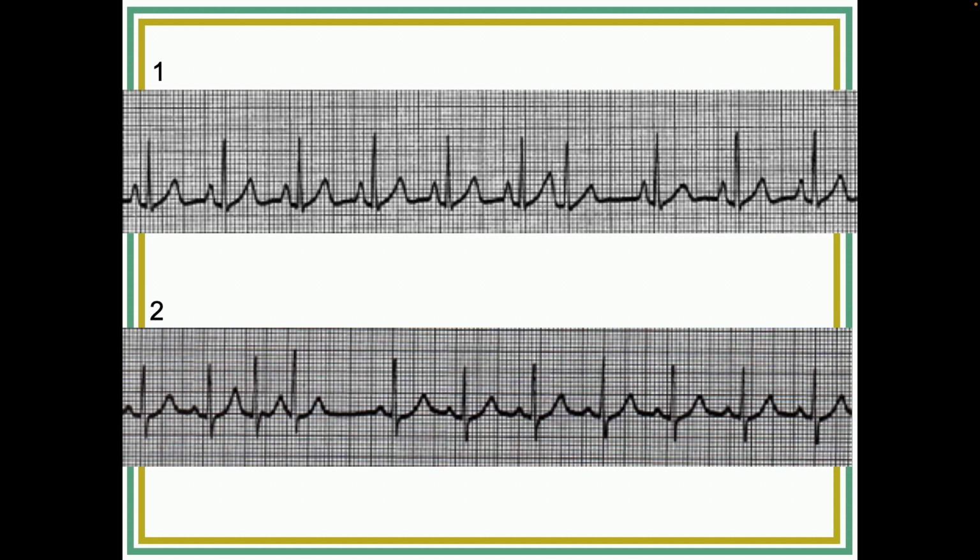And then you can move along, so you can come back to that. So if I were to ask you what you see here, the answer would be a normal sinus rhythm with a premature beat. Later today, we're going to start identifying what kind of premature beat. But for now, all we're saying is either premature beat or escape beat. Okay? Any questions? Is there anybody here who doesn't see the normal sinus, doesn't see the premature beat? Any questions about it? Okay, good job.